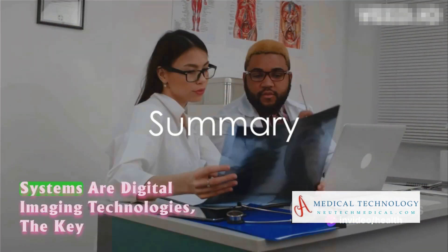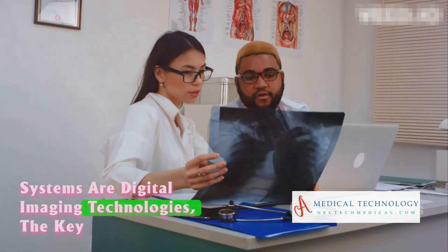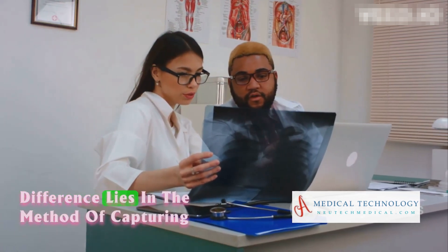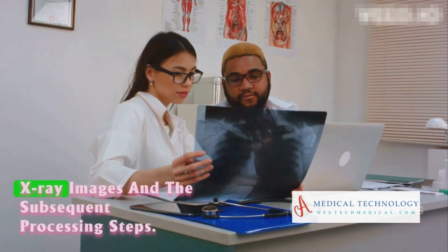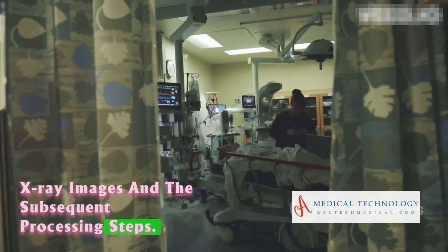In summary, while both CR and DR systems are digital imaging technologies, the key difference lies in the method of capturing X-ray images and the subsequent processing steps.